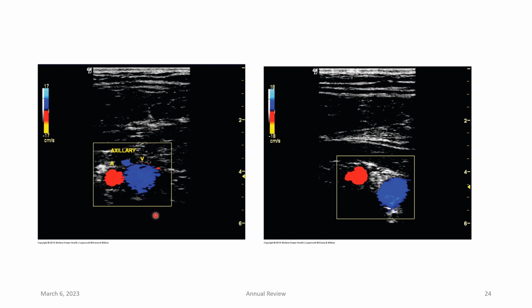Here's with color. You should also document with no color with B mode in your compressions here. Here you see it accessed from more superior in the shoulder. Then here is where you're in the more axillary region, scanning up and out, where this is where you're scanning outer shoulder in.